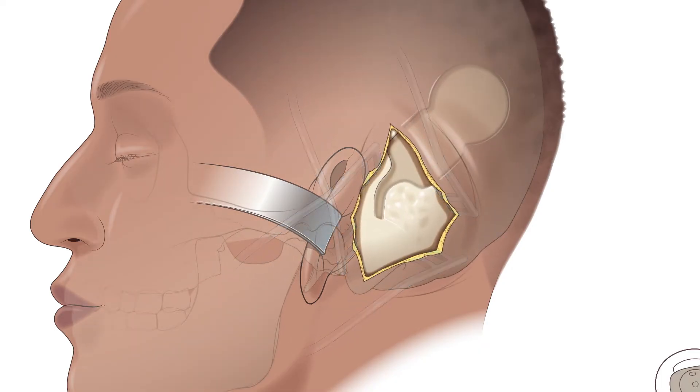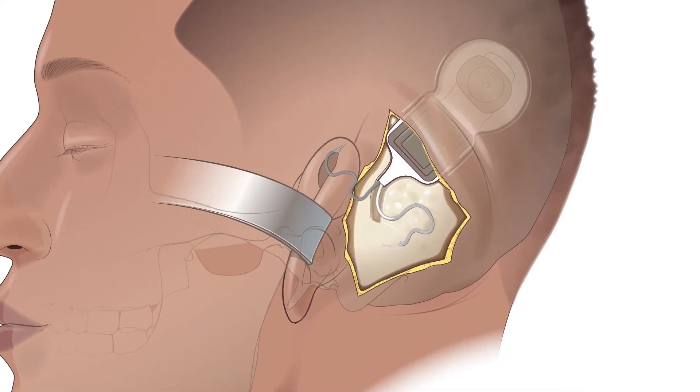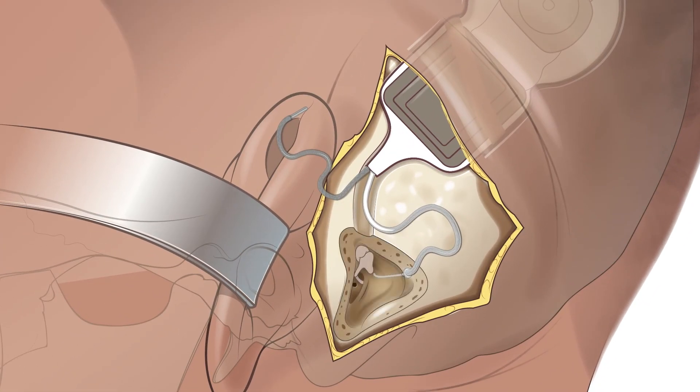The internal processor is placed into a soft tissue pocket or a small depression in the bone. The surgeon drills away some bone in order to reach the cochlea. The electrode array is then inserted into the cochlea in a slow and controlled fashion.